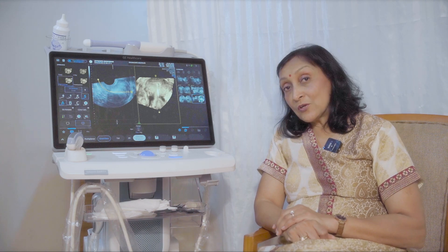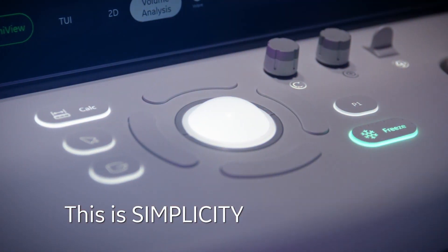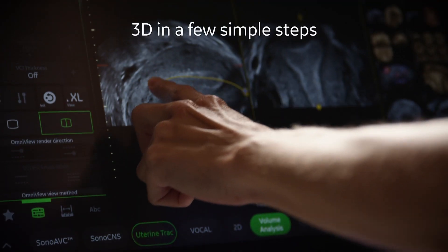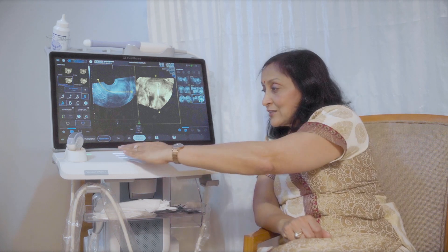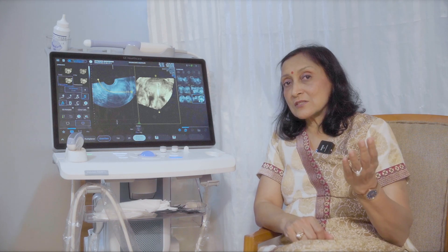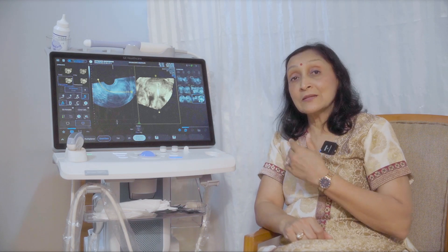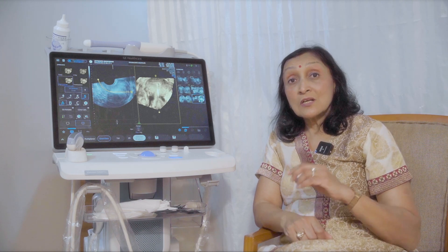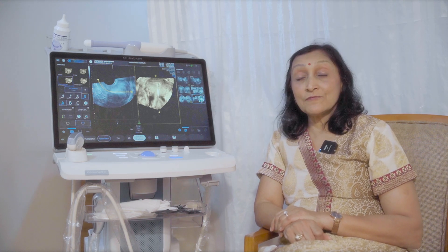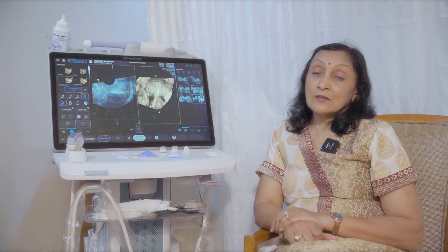Moreover, because everything is on the touch screen, there is hardly anything physical on the machine. It's very easy for me to clean it, and I can just shift it from my examination room to the OT and from the OT back. This is something which is truly a very comfortable and convenient model for a person who has to do interventional ultrasound as well as routine scans.